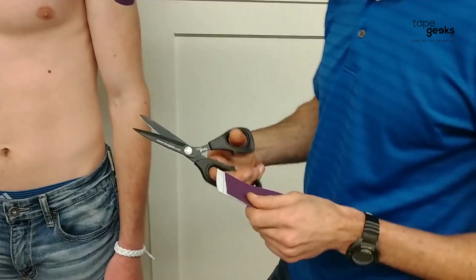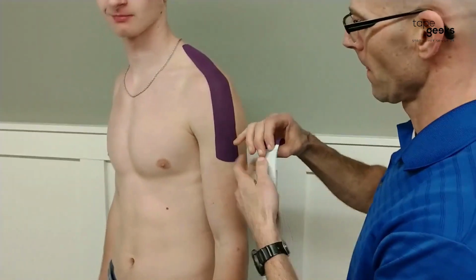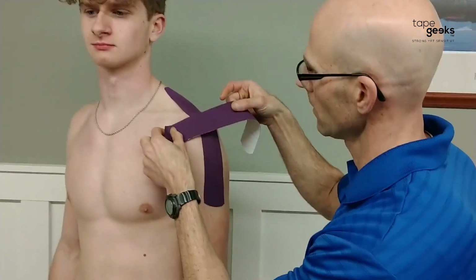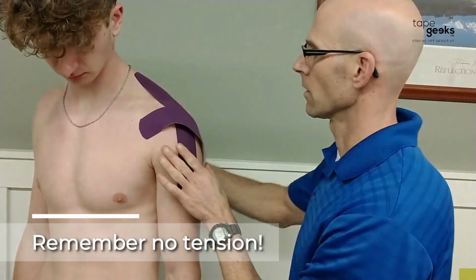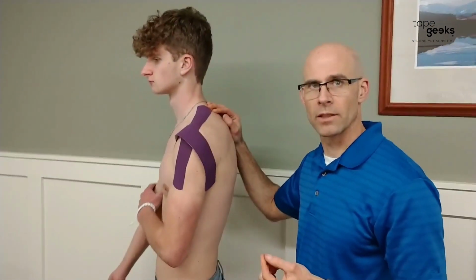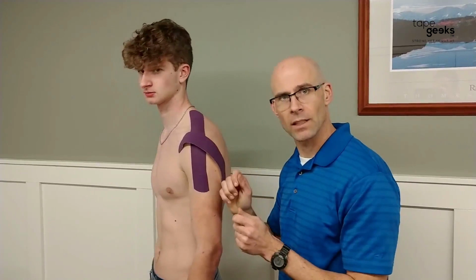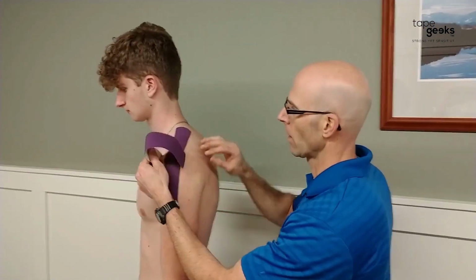Very careful not to cut your fingers. Excellent scissors, very sharp. Now we're gonna lay this down again. No tension. Okay, let's come around this way a little bit. Now if I'm trying to do what's called a mechanical correction, we're putting about 50% tension on the tape. Remember, anything over 50% is not going to have that recoil effect, but anything 50% and under does give a recoil, so it's going to cue the individual or those muscles to help fire off.